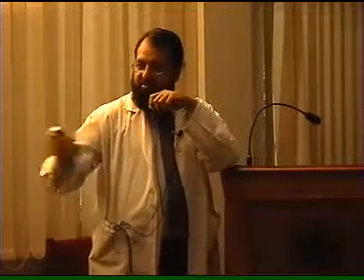Yes? Now if you have a paper of 1 minute, 1500 small squares, and then you count the number of RR intervals, you can get the heart rate per minute, but it'll be time consuming.